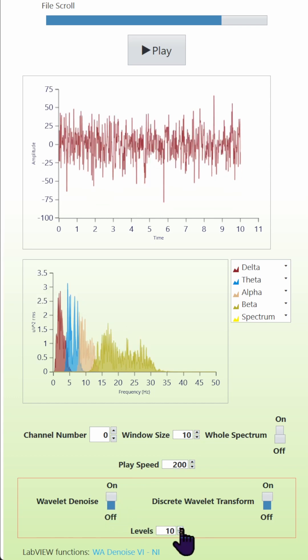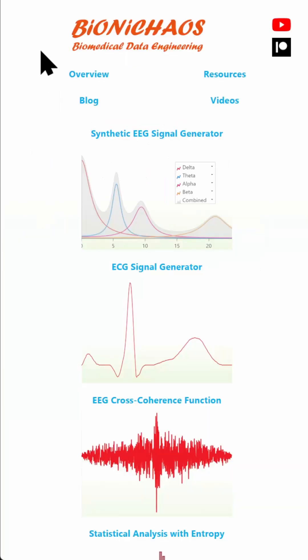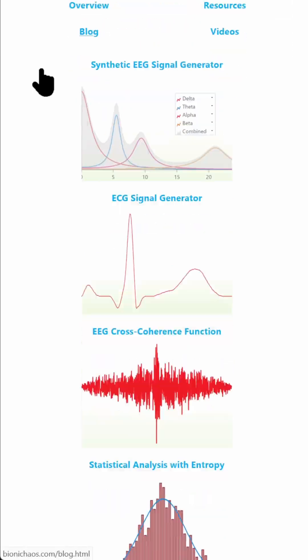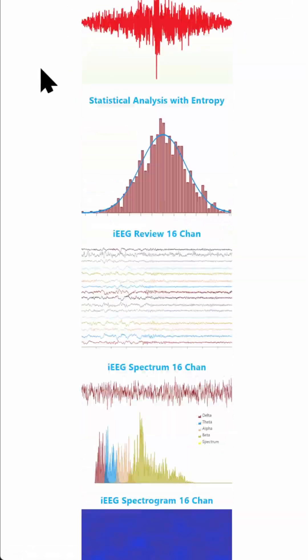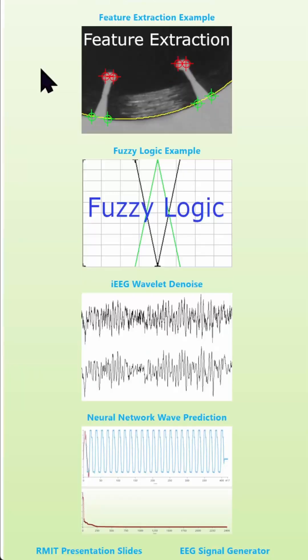One is the least aggressive. Beyond 10, it stops making any difference. So play around with it, let me know what you think. There are many useful algorithms on bionichaos.com—please go and try them out.